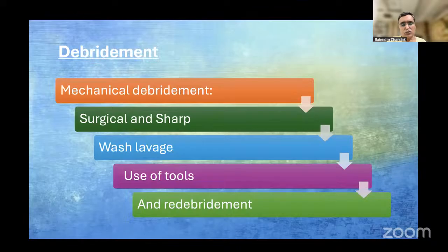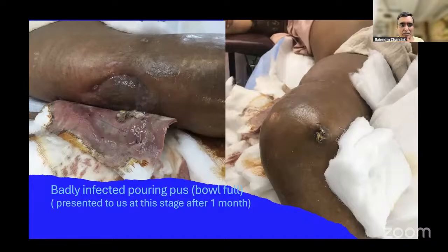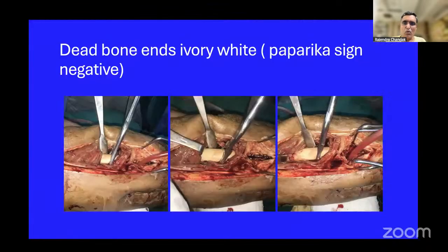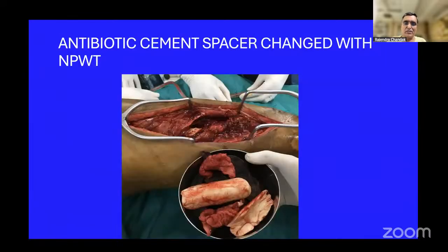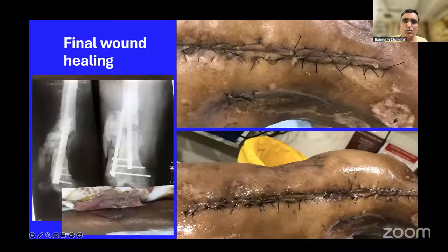The debridement has to be as thorough as we all preach every time. This was a patient who came after a nailing procedure and had free flowing pus, so much so a full bowl of pus flowing freely. And also had a dead sequestrum inside. So we had to debride the bone also, and apply negative pressure wound therapy. These were the successive X-rays where we used elution also, around 6 weeks post-operatively. These were the antibiotic cylinders with cement, which could lead to a good elution of antibiotic.